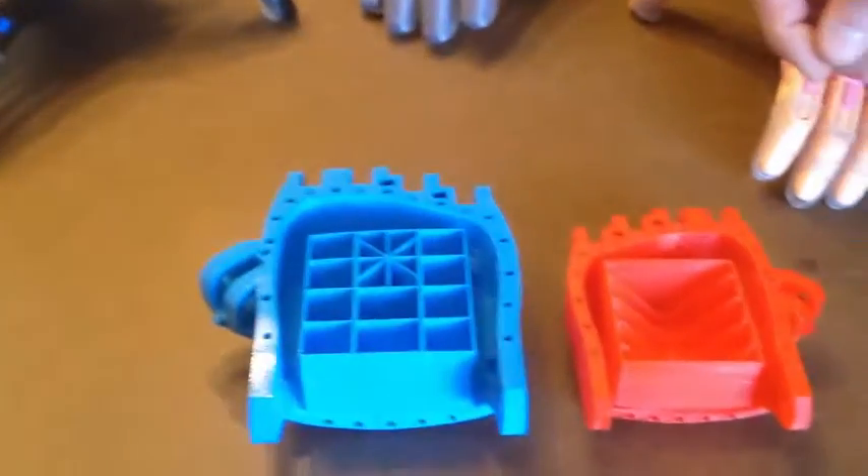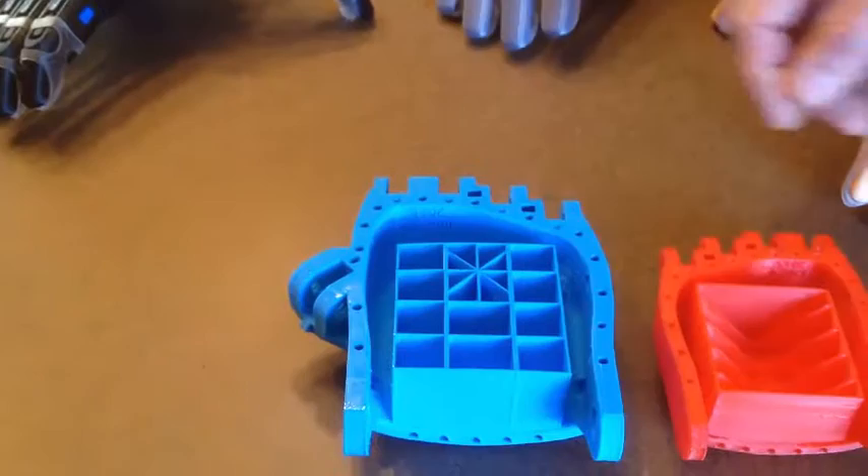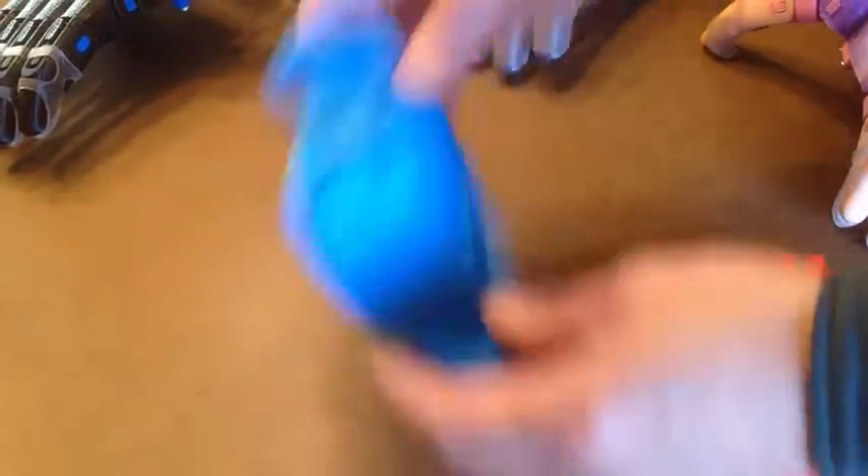the published version of the palm has a version that contains a support structure so that when it's printed, the roof doesn't collapse during the print.